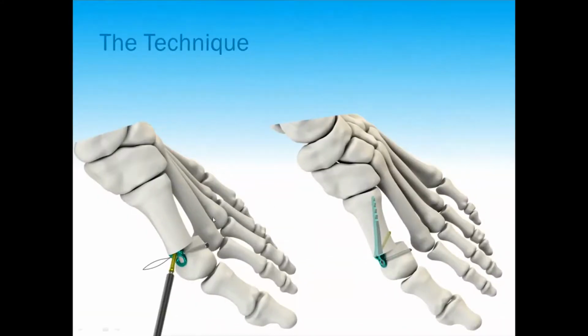So first, what you want to do is lock the implant. Once it's in the canal, you want to lock it to the proximal metatarsal segment. So this oblique non-locking screw allows you to do that. You can see that placed here.